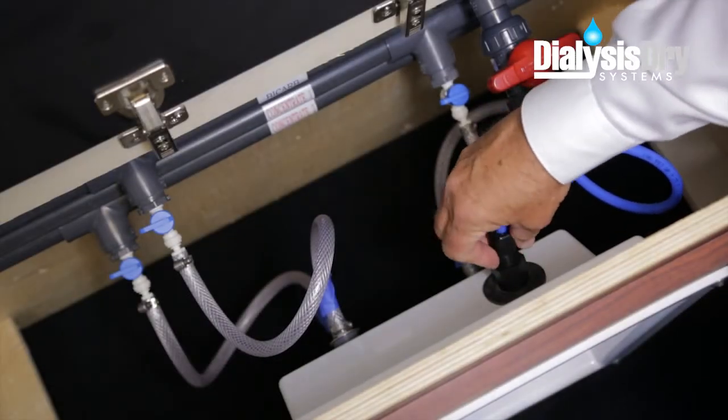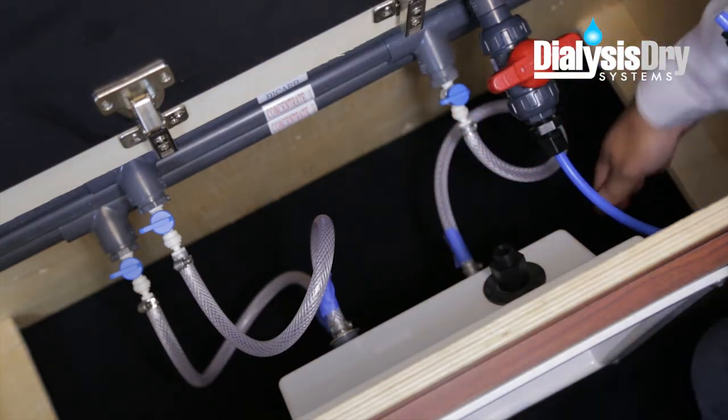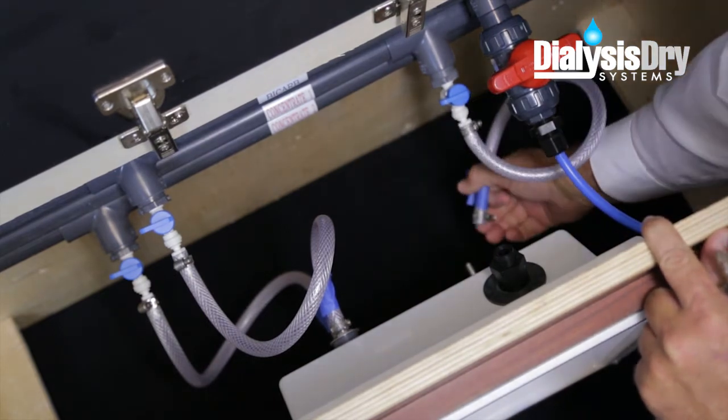Once all the tubing is labeled, disconnect each tube from the back of the supply and waste box. This may take a few minutes, but once this is done, loosely tie the tubes off to the side for interior clearance.